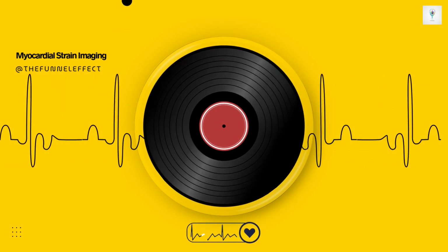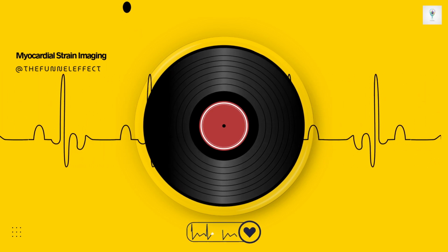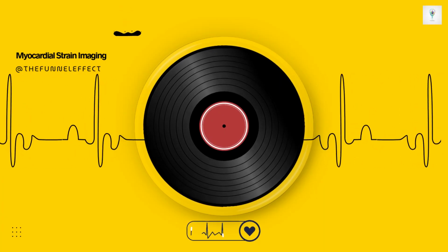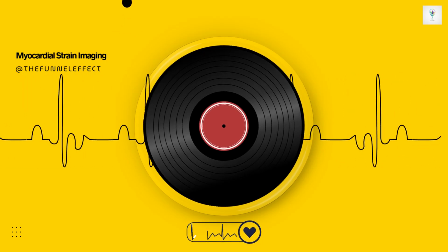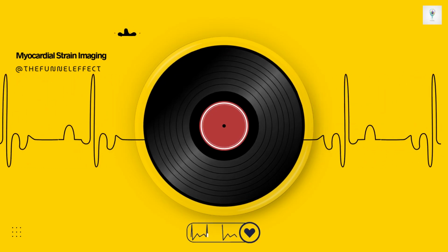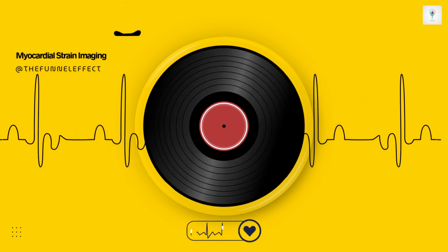You mentioned LBBB. Is there a classic strain pattern you see with that? Oh, yes. LBBB creates a very characteristic, visually striking pattern on strain imaging. Because the septum, the wall between the ventricles, is activated abnormally early, it contracts very quickly right at the beginning of systole. This causes a brief, sharp downward spike on the septal strain curve, known as the septal flash. Okay. Meanwhile, the lateral wall, which is activated very late in LBBB, is actually being stretched passively during this early septal contraction. Then, when the powerful lateral wall finally does contract late in systole, it pulls on the septum, causing the septum to be stretched back outwards. We call this septal rebound stretch. So flash and rebound stretch.